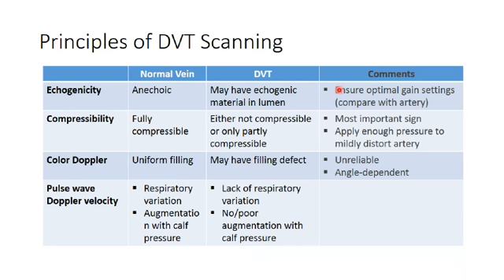Now, one comment about the gain settings for the echogenic material. Remember that gain can create noise and create a lot of echogenicity within vascular structures when there is none. How do you optimize the gain? First, make sure that the adjacent tissues do not have any noise or signals. Second, compare it with adjacent normal structures. For example, if you know that the artery does not have a thrombus, then adjust the gain in such a way that the artery is anechoic, and the subcutaneous and adjacent tissues do not have excessive noise.